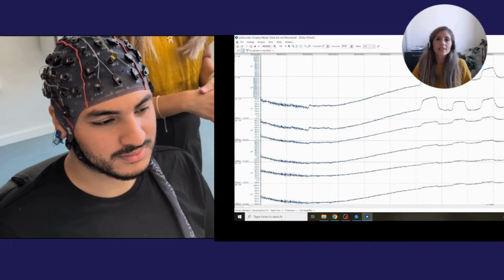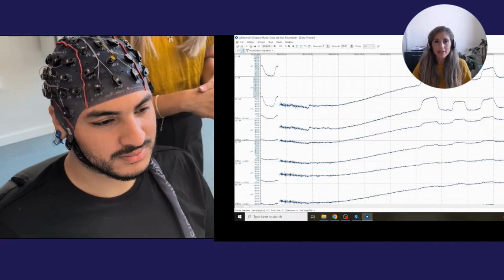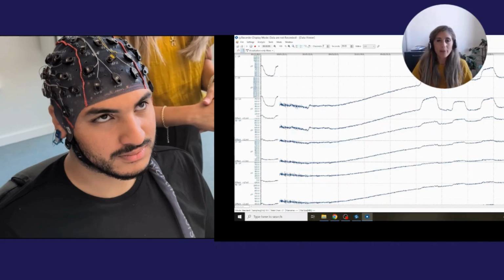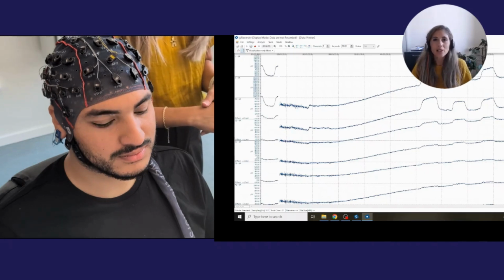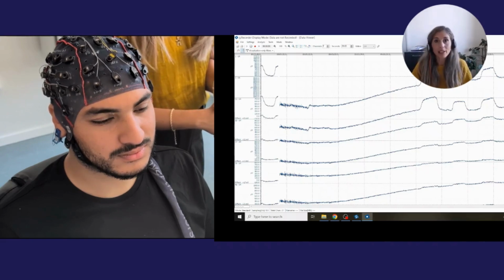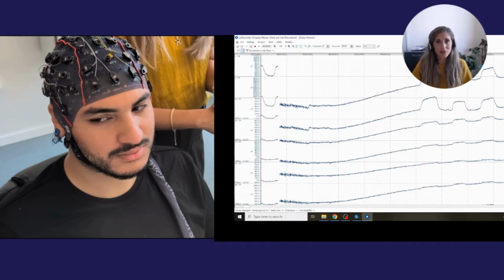Here again, you can see some artifact created by the movement of the eyes. When you move the eyes up and down and right and left, they create some slower waves, which are still visible in the frontal channels, especially in the frontal channels.